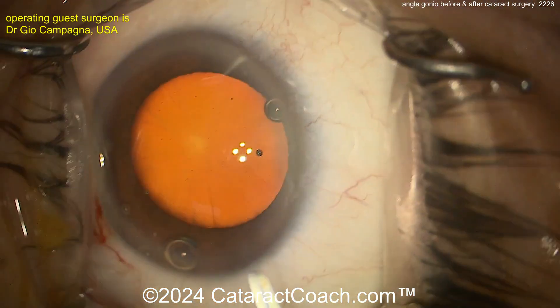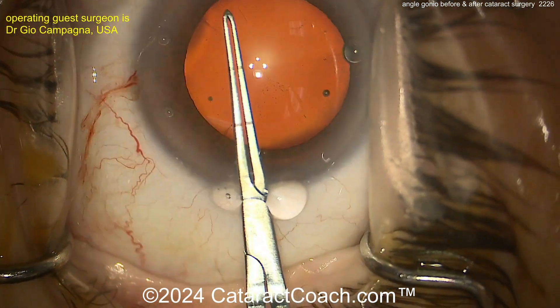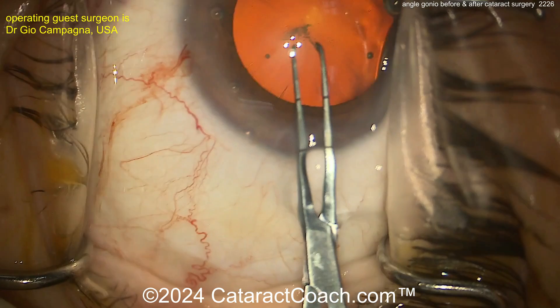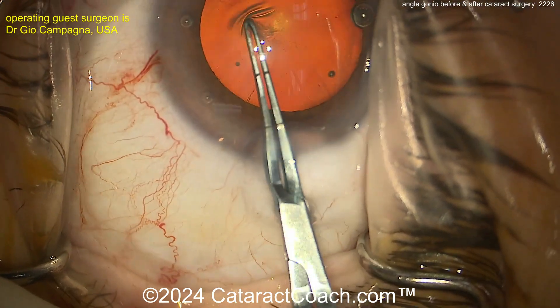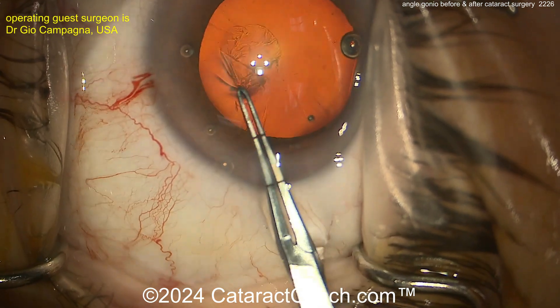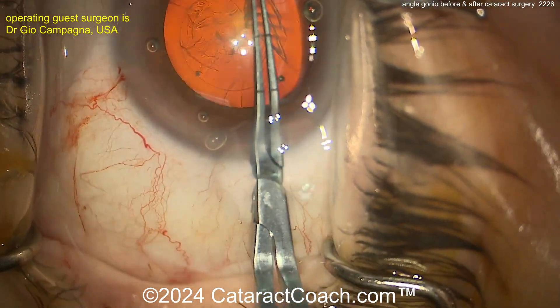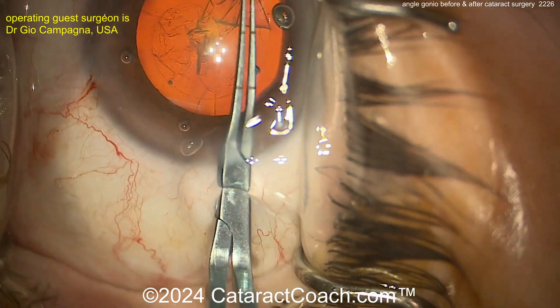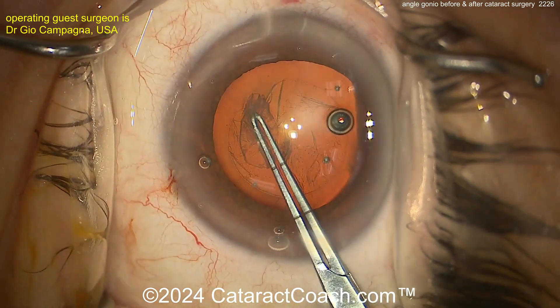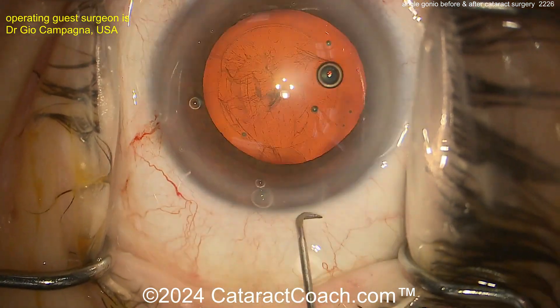When you get the rhexis done, remember you'll have a harder time flattening out that anterior lens capsule with viscoelastic, so you may be more likely to get the rhexis to run out. Be careful of that. Using forceps, poking in, getting that rhexis started. Be cognizant that you may have a shallower AC and therefore the rhexis may want to run out. If you need to put more viscoelastic, definitely put more. That looks like a good 5-millimeter rhexis.